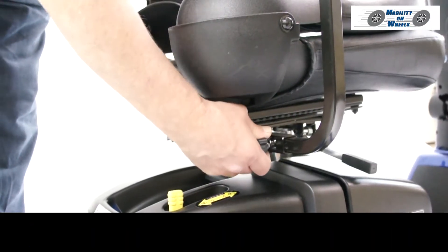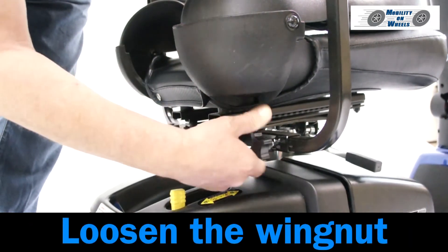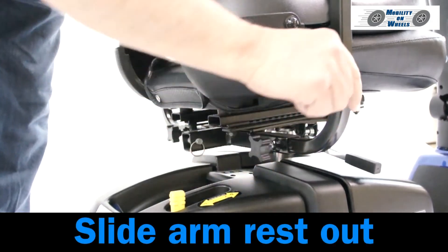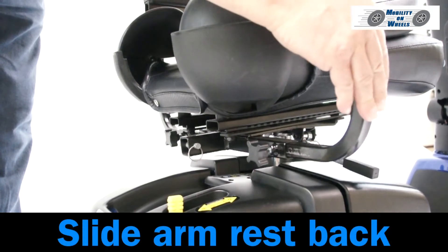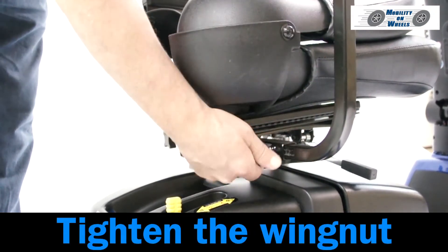To adjust the arm width, loosen the wing nut located under the seat. Slide the armrest out, then slide the armrest back, and tighten the wing nut.